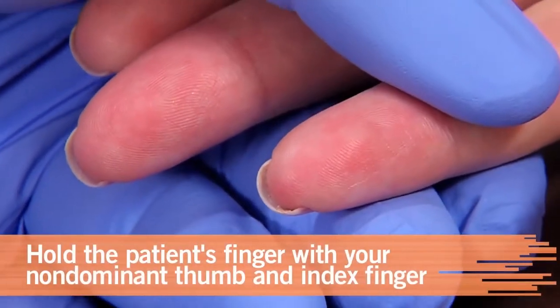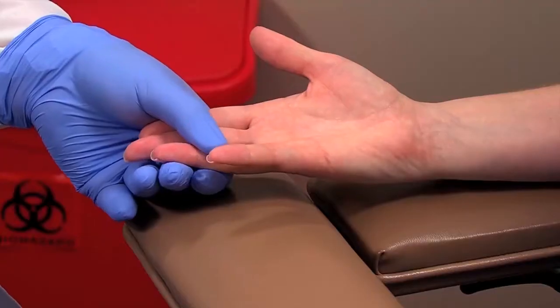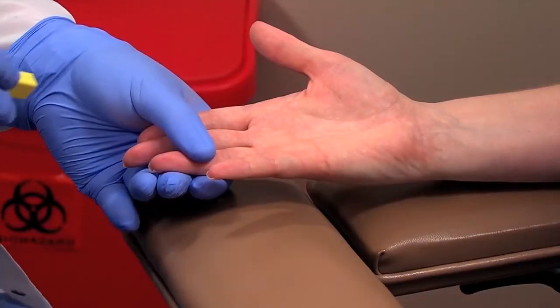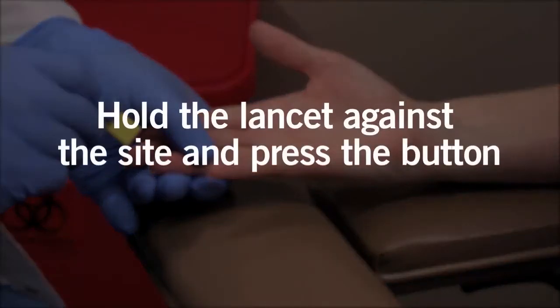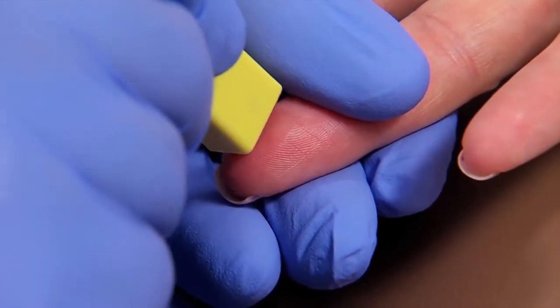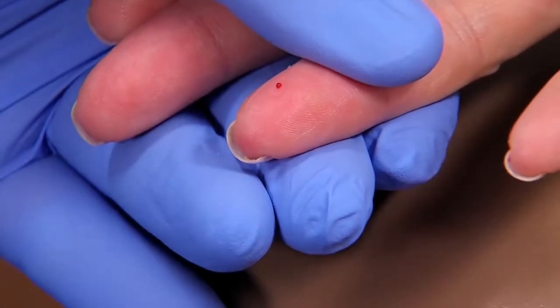With your non-dominant index finger and thumb, hold the patient's finger on the sides near the puncture site. This gives you better control of the puncture, which you'll perform with your dominant hand. Hold the safety lancet against the patient's finger and press the button to activate the needle or blade. After puncturing the skin at a specific depth, it'll automatically retract.